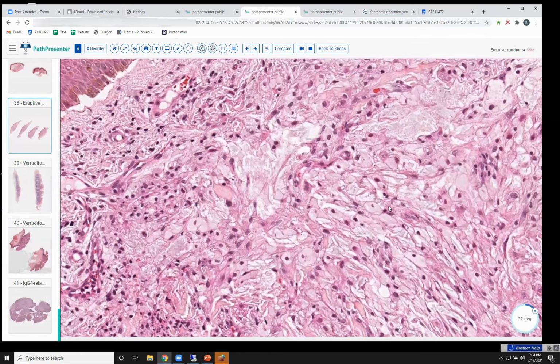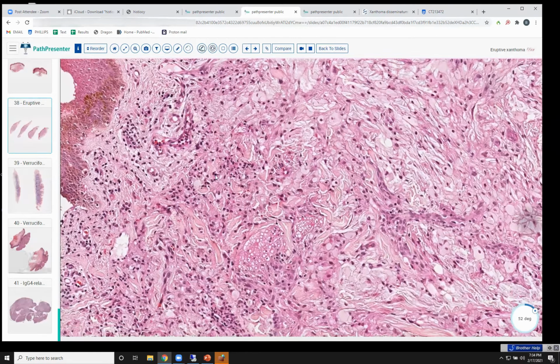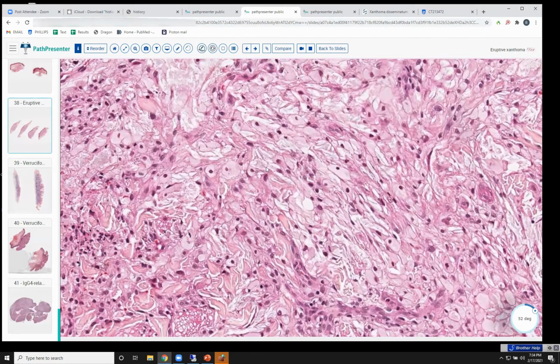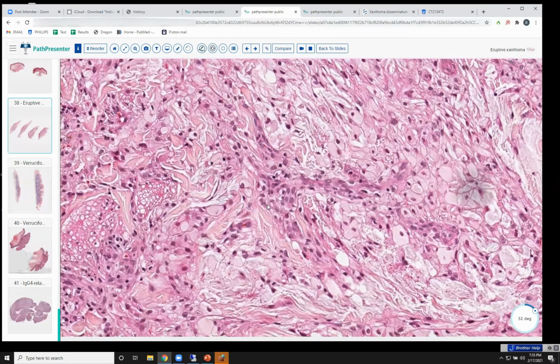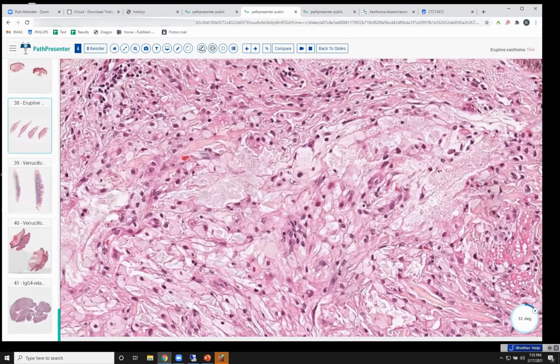I just wanted to show you, neither is xanthelasma, but I want to show you that these are a different histology. So these are xanthomas, and there's tuberous, tendinous, plain, diffuse, normolipemic, and they all look the same. They all have xanthoma cells, and they're not part of the histiocytoses, xanthomas.